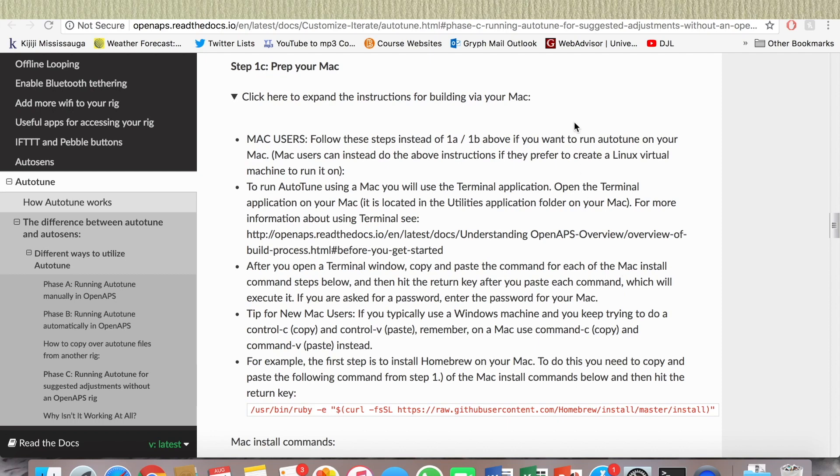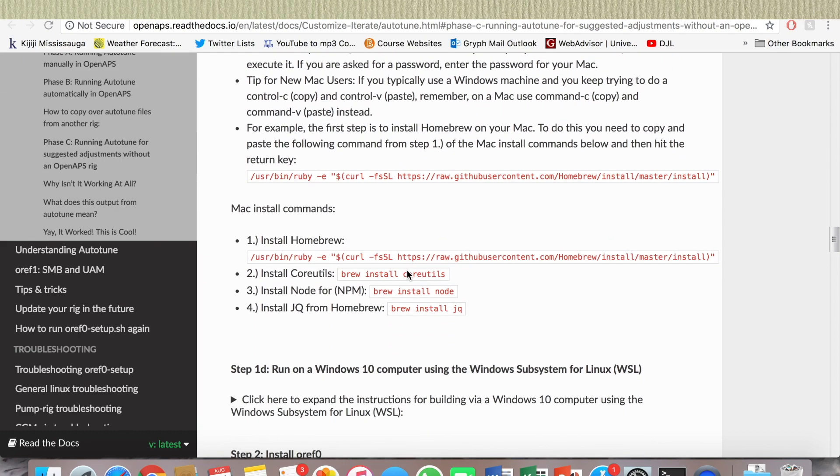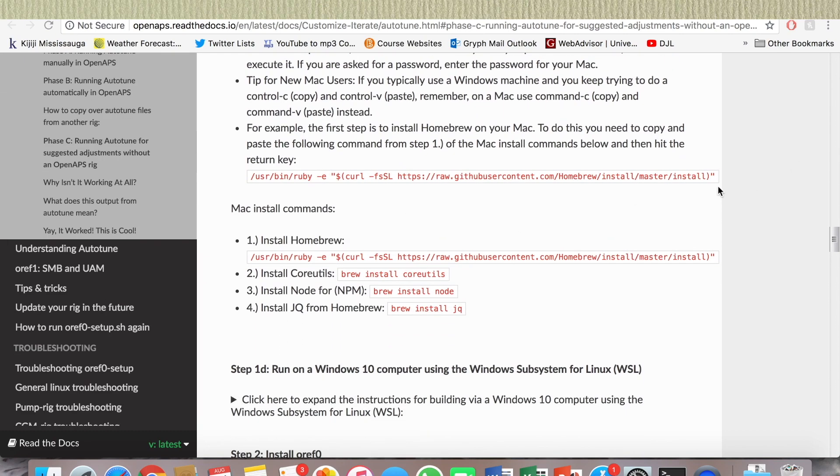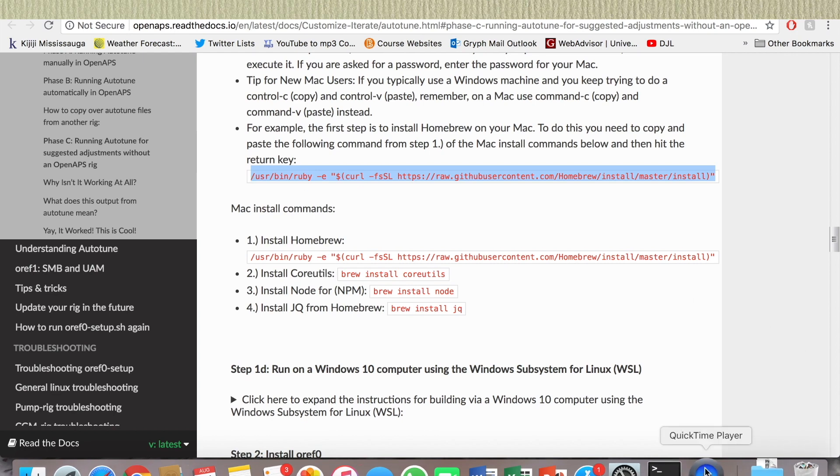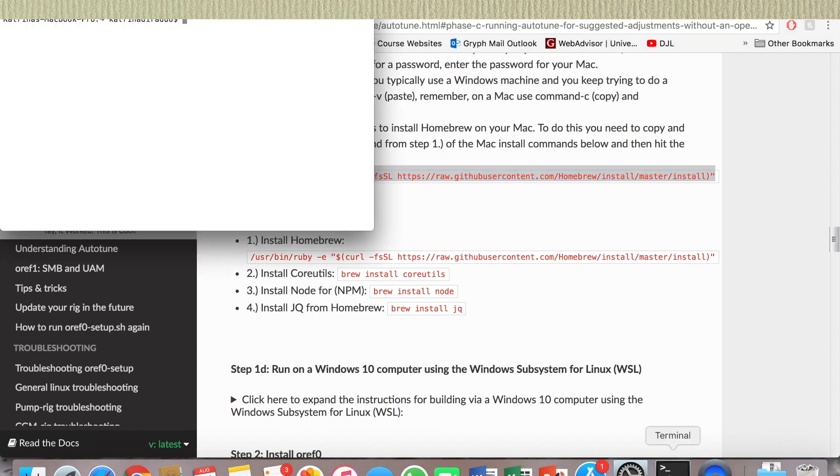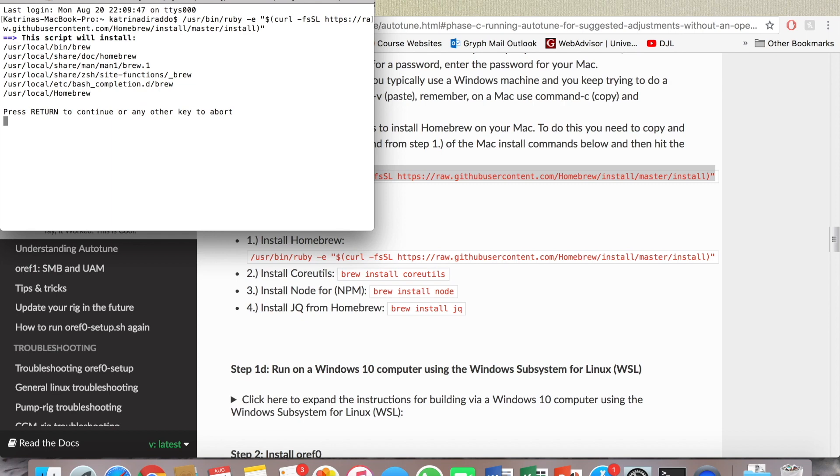Okay, so I figured I would start from the beginning just to make sure I'm not doing anything wrong. I'll go from the first step, copy this here, paste it in my terminal, press return to continue, password.